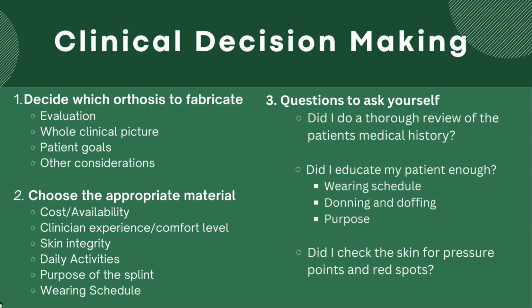They have to wear it all day. They can't take it off. They just had a flexor tendon repair. It needs to heal. How to take it on and off, how to don and doff it, along with the purpose. Some patients, if you do not explain all of this to them, they will take it off. They will not be compliant with wearing their splint. So this is very, very important to ask yourself.